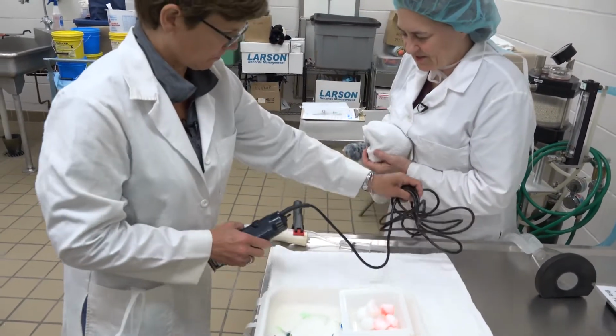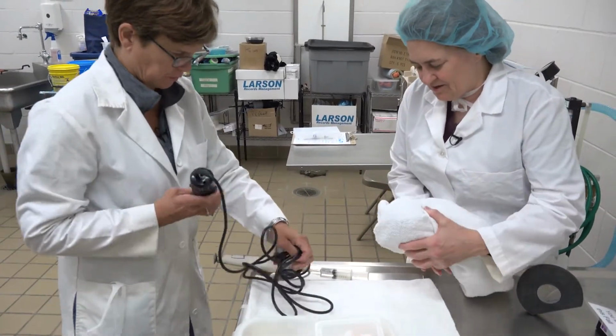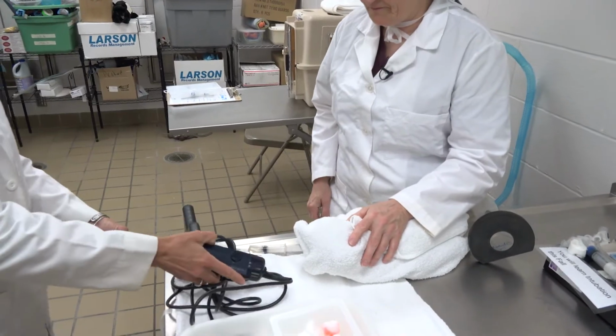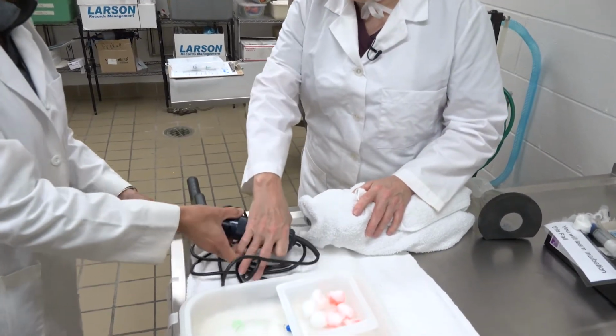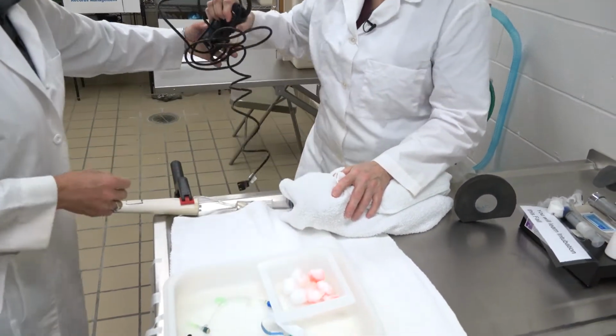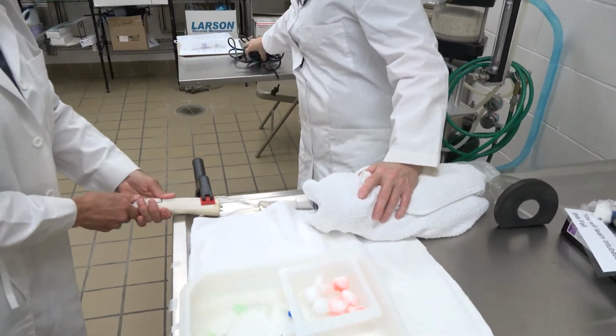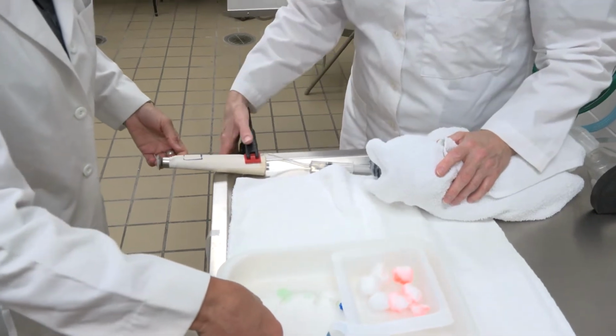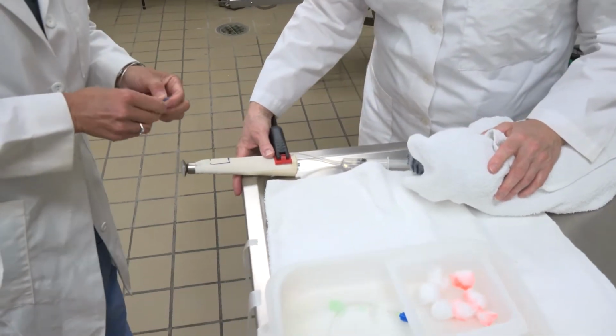Okay, here's our little kitty. Okay. So we will pretend shave. It's our dry run. Oh, magic of TV. I'm going to get this for you. Put those on so someone else can use them. And now we have a nice area for our catheter. I'm going to practice my catheter placement.